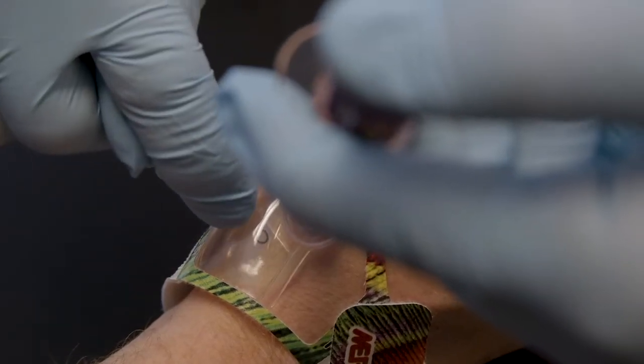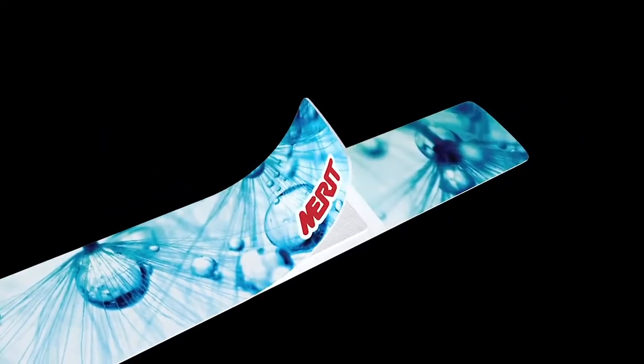A clear curved backer plate provides optimal visualization of the puncture site and ease of placement. For a large patient wrist or hand, you may add the extension band prior to placing the Prelude Sync Distal.